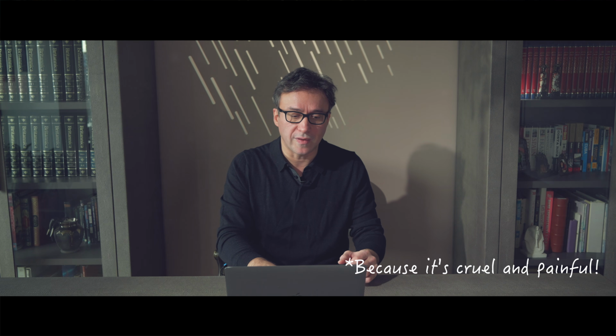So I never do the intrapulpal anesthesia as a primary source of anesthesia because the requirements for this are having an intact roof of the pulp chamber. The anesthesia is done through pulp horns, and it's actually a pressure anesthesia. So your type of anesthetic matters less than having pressure, and that is really the key point. You do need to have an intact pulp for these cases.